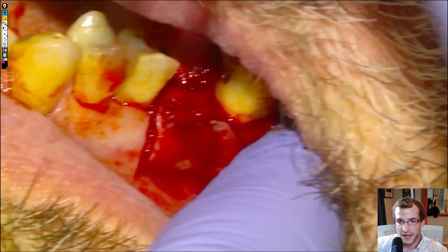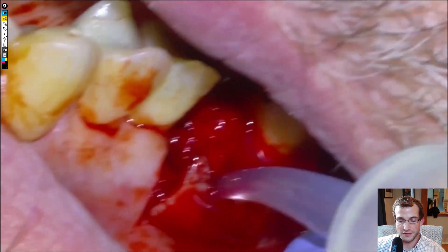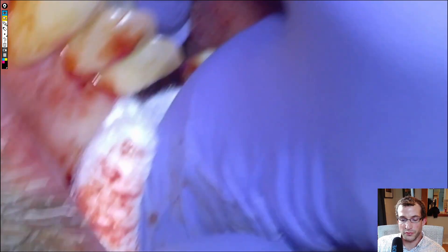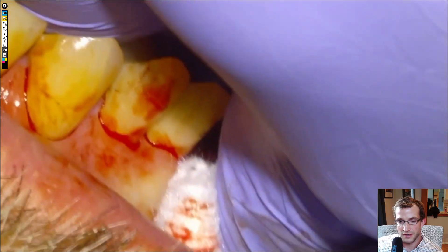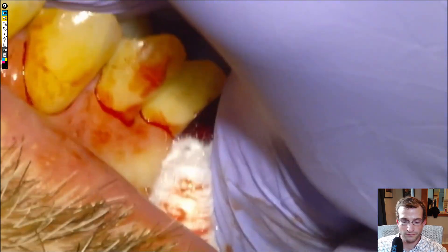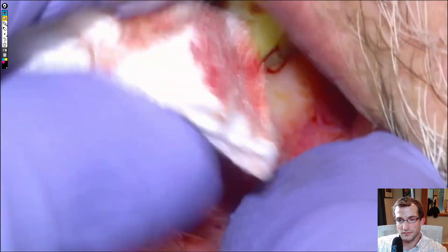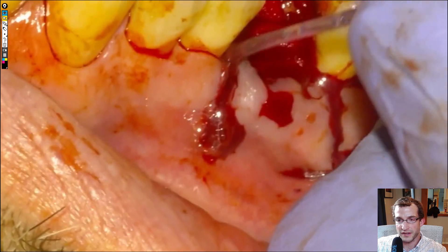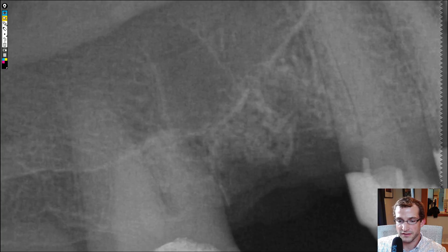Then we'll close up the flap. If I could go back, I'd probably suture this one, but for some reason decided to try to use a tissue adhesive. Tissue adhesive likes to have a dry site in order to work well. We can place our thumb on the gum tissue to try to get it to stop bleeding fully, but it doesn't really work that well, so the adhesive was a little bit messy. Not a great site to try to use tissue adhesive in retrospect, but it healed up just fine anyway. We'll take a PA to verify that everything's out, and that's going to be it.